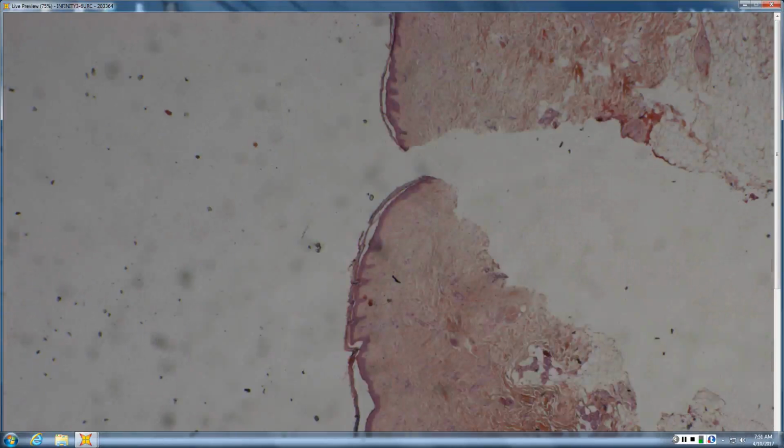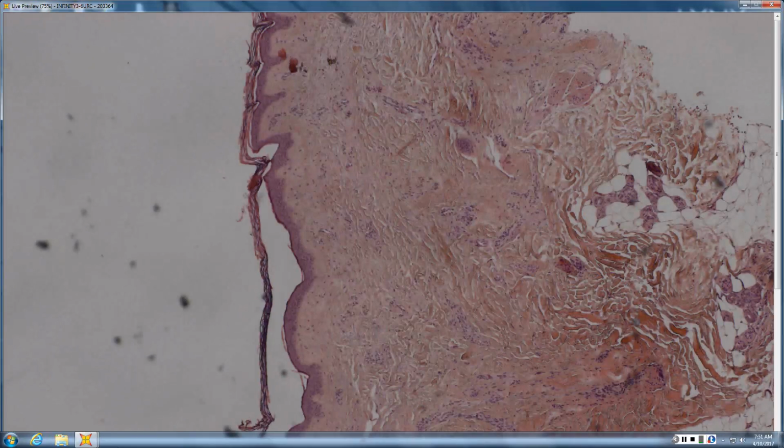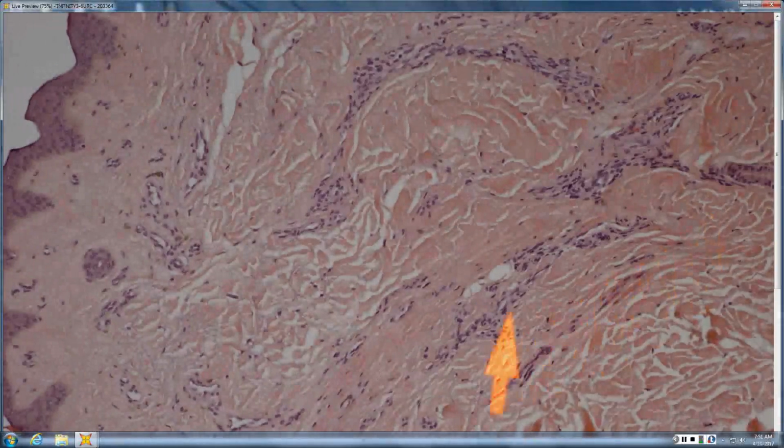So what if this were a scalp biopsy? I would be concerned that the patient has an alopecia, since there's not a whole lot, including not a whole lot of hair. And then there might be some kind of scarred fibrous tracts. When you look at the fibrous tracts, are they particularly wide? No, they're narrow. How about when you get to the top? Much wider, maybe even wedge-shaped.